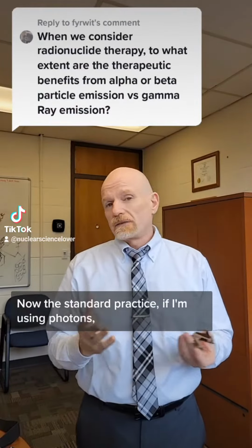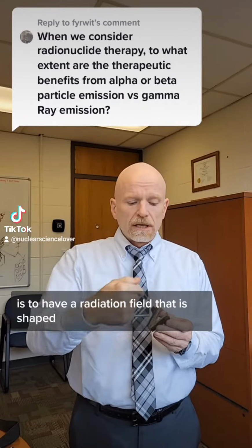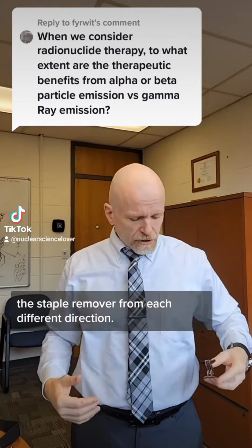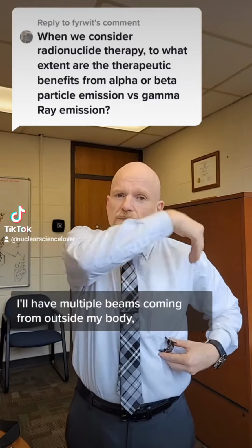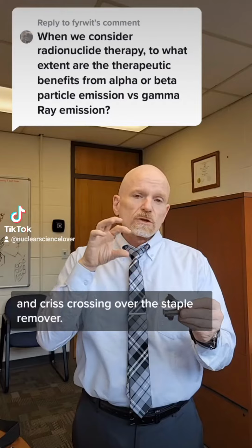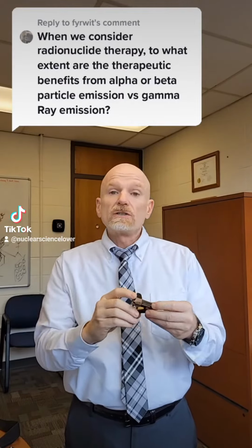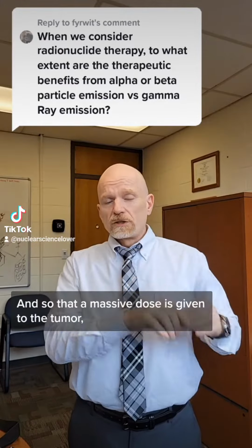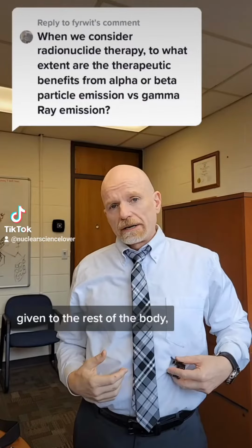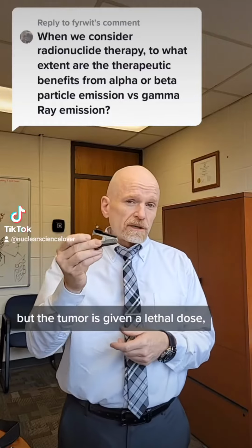Now, the standard practice, if I'm using photons, is to have a radiation field that is shaped like the staple remover from each different direction. So if it's in my body, I'll have multiple beams coming from outside my body and crisscrossing over the staple remover. So from each direction, it maps out the shape of the staple remover, so that a massive dose is given to the tumor, where only a smaller dose is given to the rest of the body. So that the tissue that's around the tumor has a survivable dose, but the tumor is given a lethal dose.